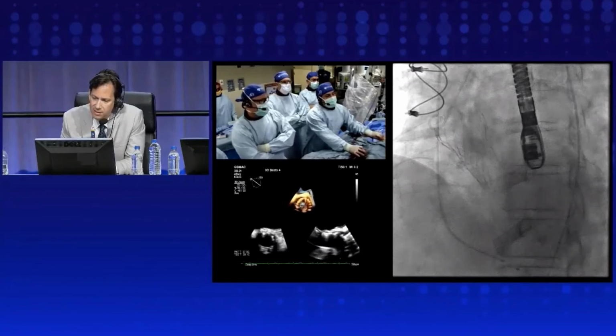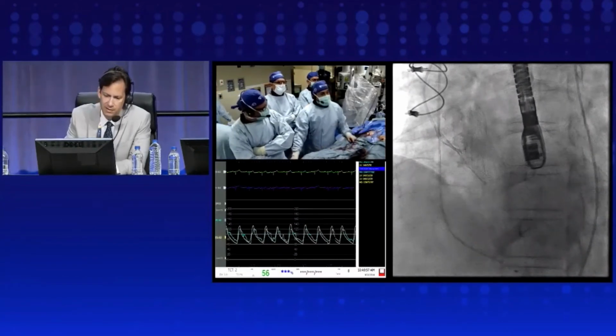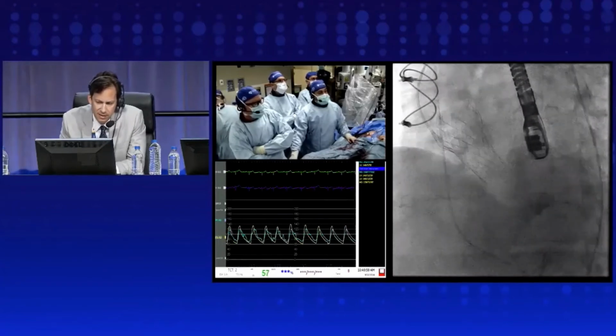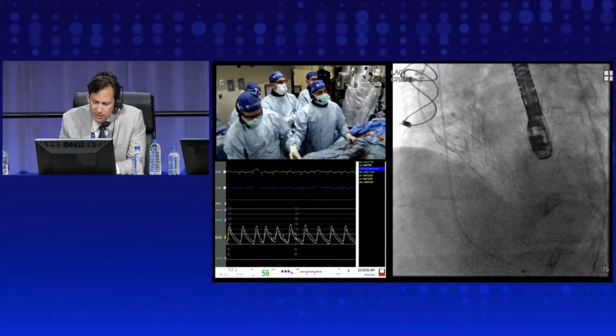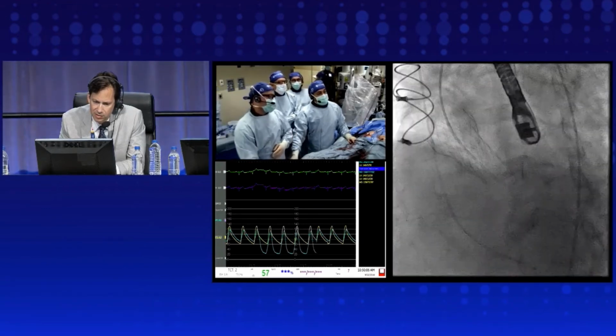Yeah, we're just going to wait a little bit, and the pressure's good, diastolic's good, so the flow is good. But we just came off pacing, so that's her regular sinus rhythm now. To John's EKG point, it is normalized, but we'll do another shot for sure. Completely agree. We're just planning on waiting.